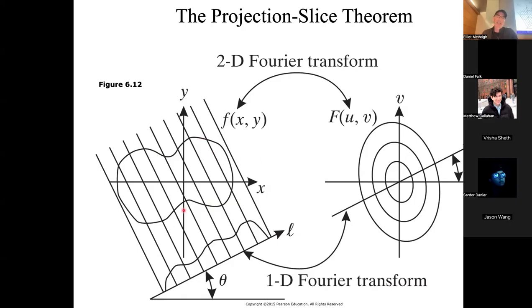So if you have an object in the plane, whether it's a person or a grapefruit or anything sitting there, and it has a pattern, f(x,y), some features, when you do this integration of that pattern and plop that down here as the value for that projection of the object, we get this function, G(L, theta).